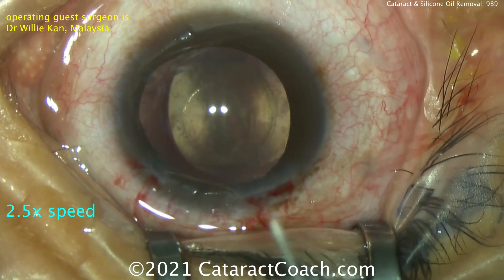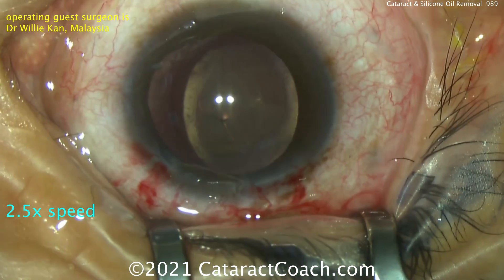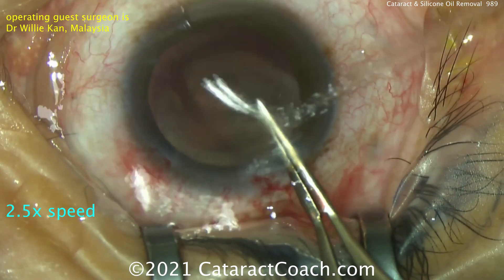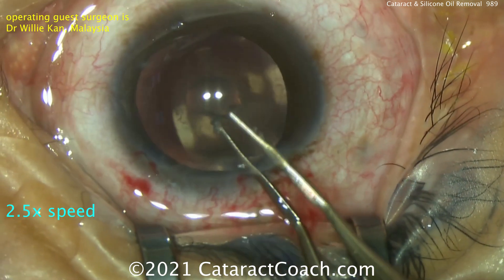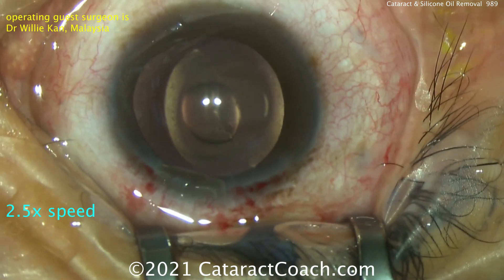You can certainly do a pars plana incision to access the vitreous, but here a posterior capsulorhexis is a very elegant solution. Using a cystitome to poke the posterior capsule, and now using forceps to create a nice capsulorhexis. There's now a posterior capsulorhexis of about three and a half to four millimeters in diameter — certainly smaller than the anterior capsulorhexis.